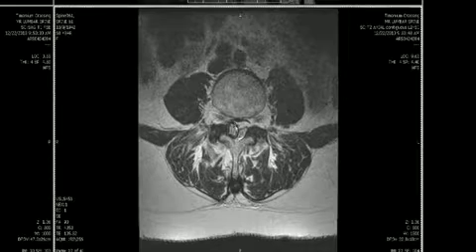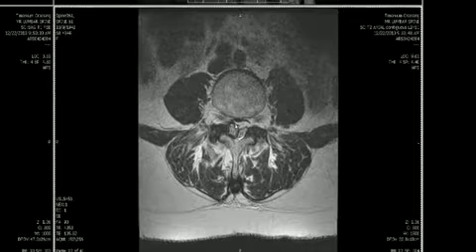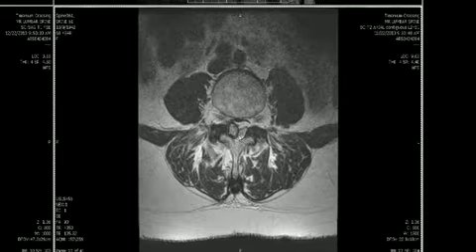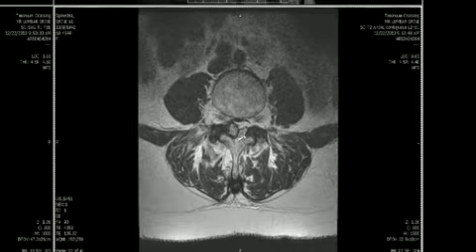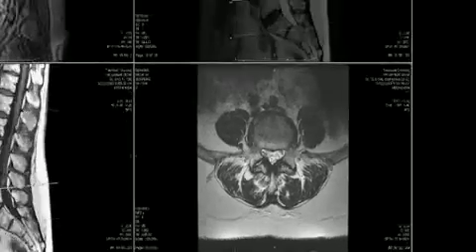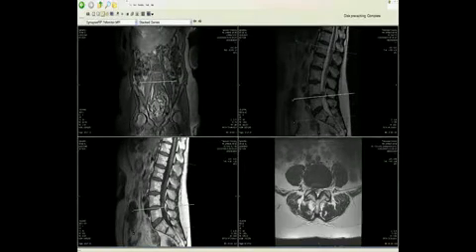The best diagnosis here is a synovial cyst. Synovial cysts are known to have a propensity for hemorrhage, and the low signal intensity is most likely secondary to hemosiderin blood products in the periphery of the synovial cyst. Alternatively, the low signal intensity could be due to displaced ligamentous fibrous tissue. In any case, this does appear to be the source of the patient's right-sided pain.